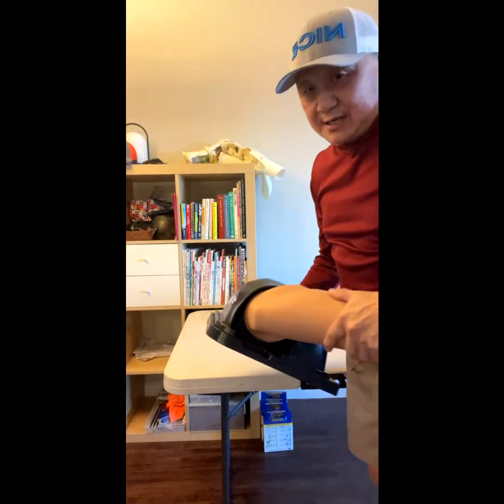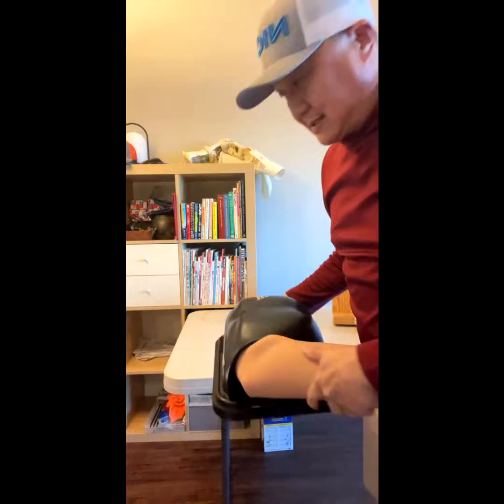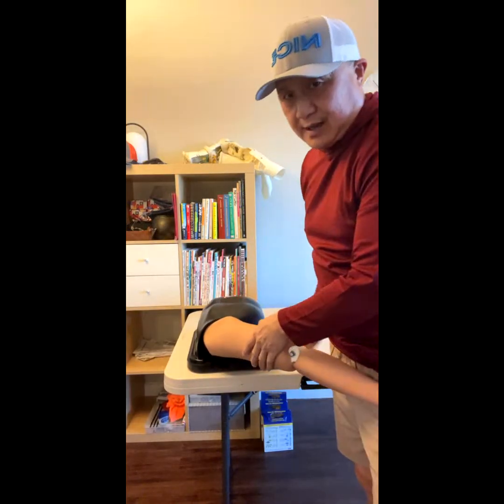It has skin on it so you cannot see what's going on inside, but it's dislocated — anterior.